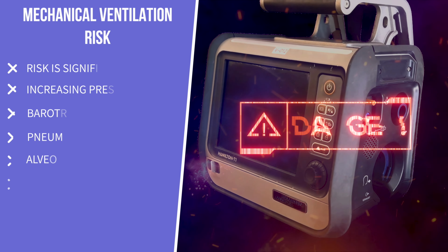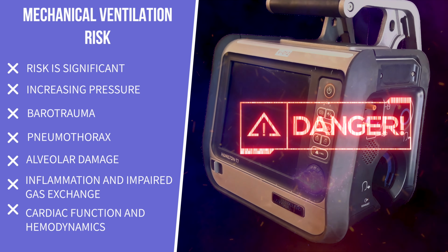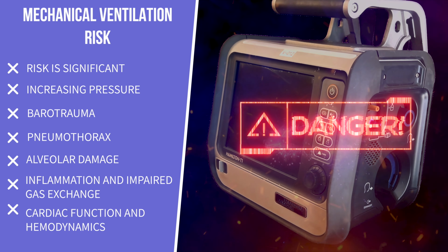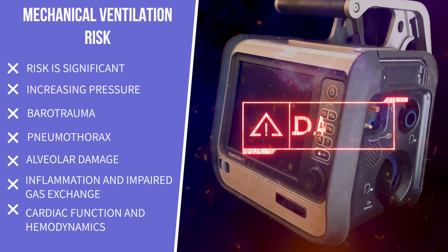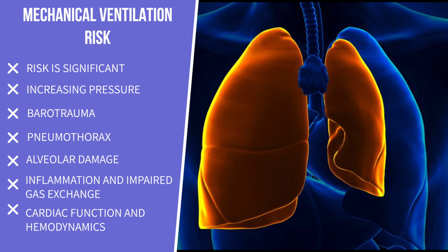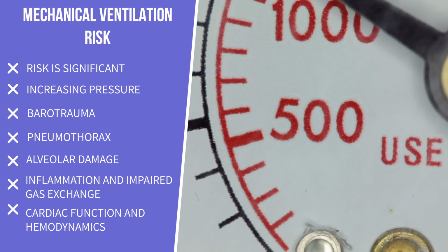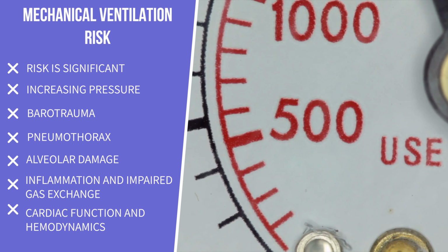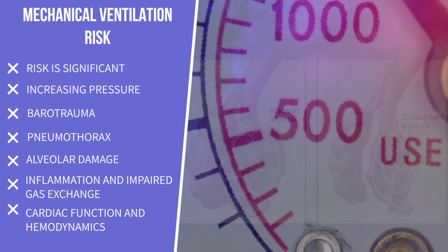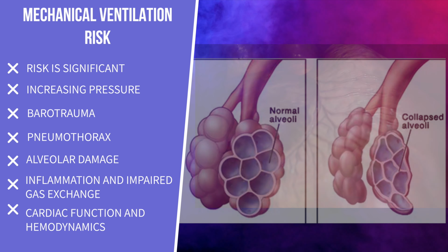While positive pressure ventilation offers significant benefits, it is vital to be aware of the potential risks. Increasing the pressure in the lungs can lead to barotrauma, causing complications like pneumothorax. High pressure ventilation can cause mechanical stress and strain on the lungs, leading to ventilator-induced lung injury. This may manifest as alveolar damage, inflammation, and impaired gas exchange.